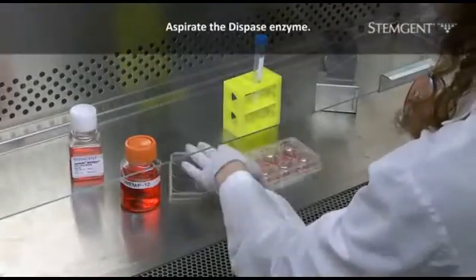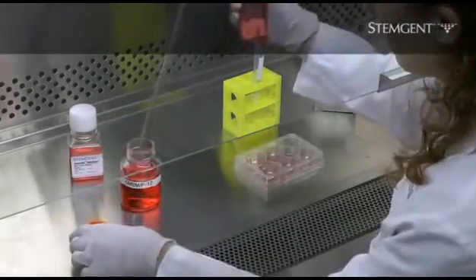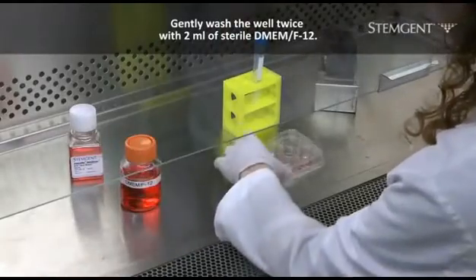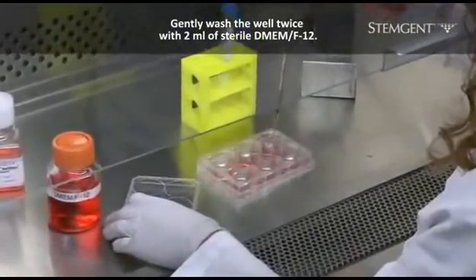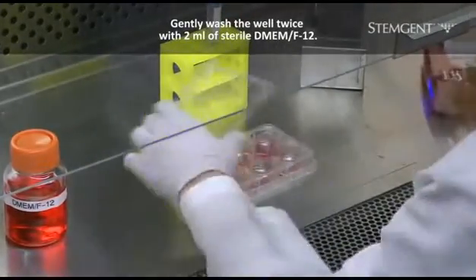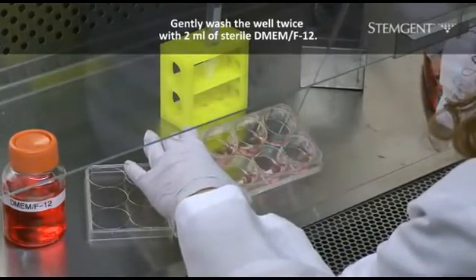After removing the plate from the incubator, aspirate the dispase enzyme. Gently wash the well twice with 2 milliliters of sterile DMEM F12. Please note that DMEM F12 should be added very gently to avoid detaching the cells from the surface of the plate.